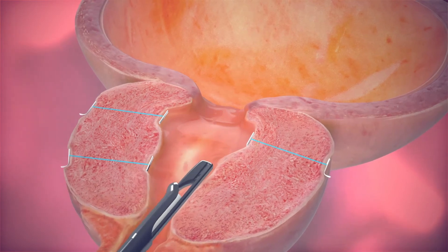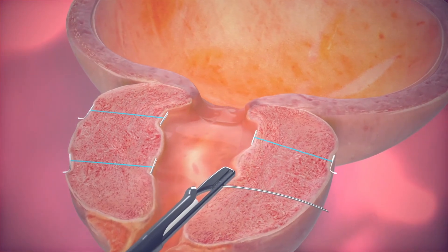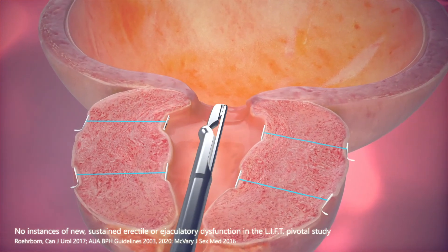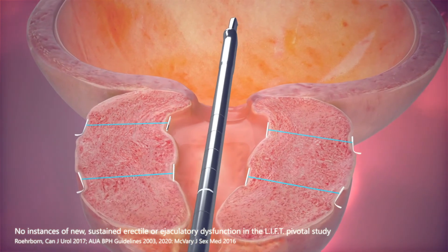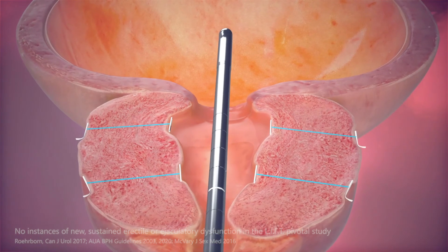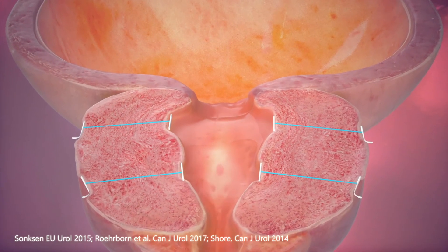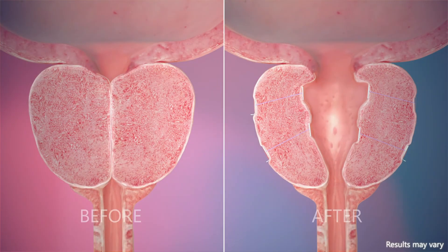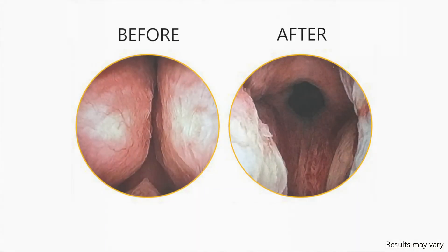The minimally invasive procedure requires no cutting, heating, or tissue removal. This procedure avoids erectile and ejaculatory dysfunction. It typically also means minimal downtime, mild to moderate side effects, and a quick return to normal activity. The UroLift system provides a clinically proven treatment for men who suffer from an enlarged prostate that can help men get off BPH medications and may help avoid major surgery.